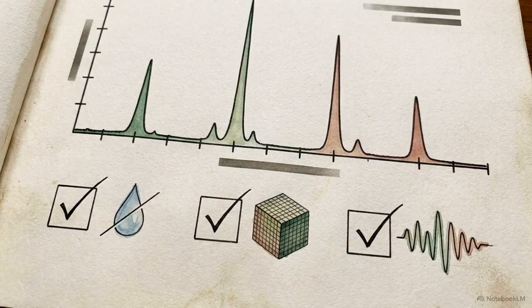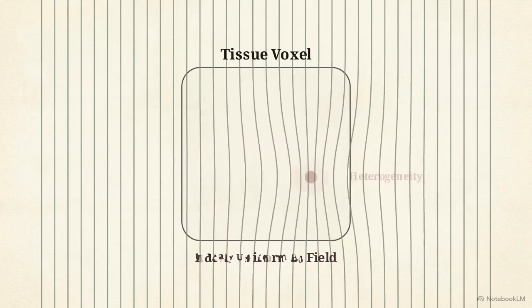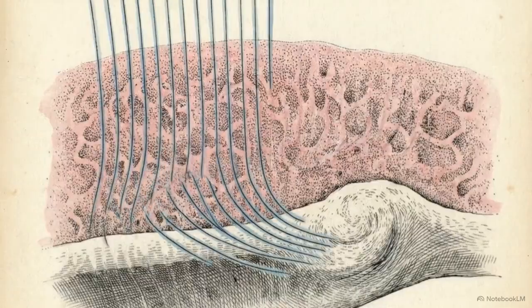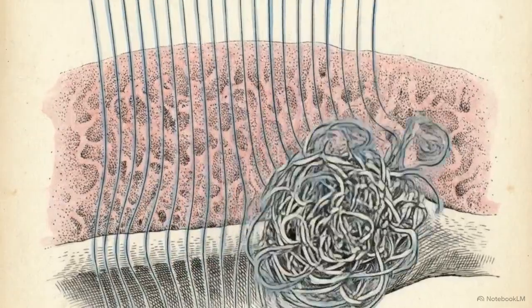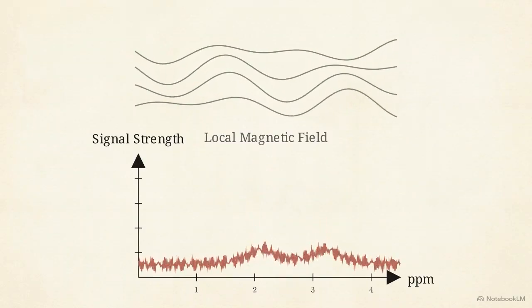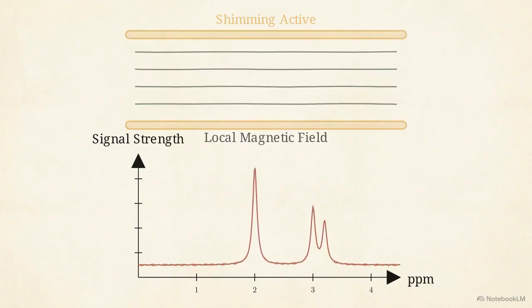data would remain invisible. Despite its chemical precision, MR spectroscopy is inherently low resolution compared to standard anatomical MRI. It is also extremely vulnerable to local magnetic field heterogeneity. Imaging close to bone, calcium deposits, or flowing blood disrupts the uniform magnetic field lines passing through the tissue. These physical distortions ruin the subtle Larmor frequency shifts we rely on, causing severe artifacts in the final spectrum. To correct these local distortions, the machine requires a mechanical countermeasure called shimming, which actively homogenizes the magnetic field.